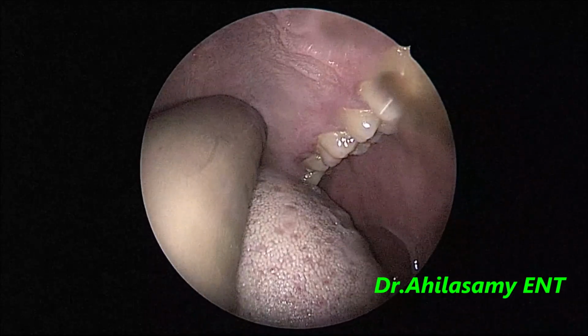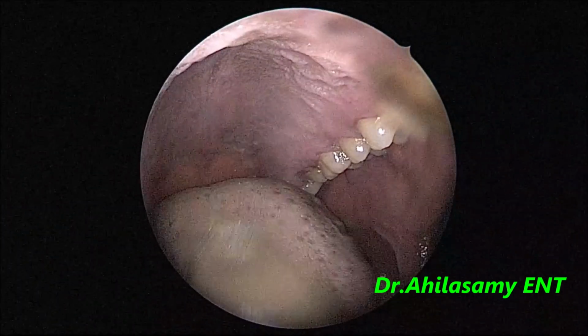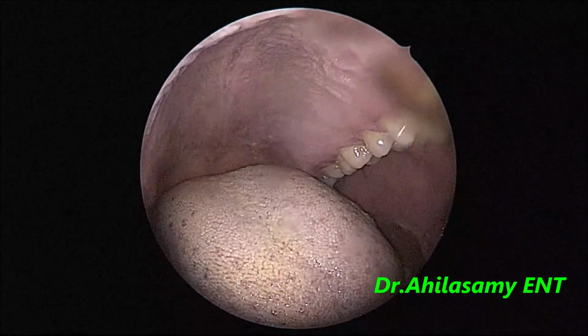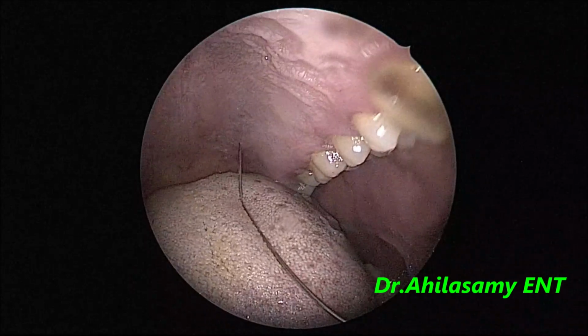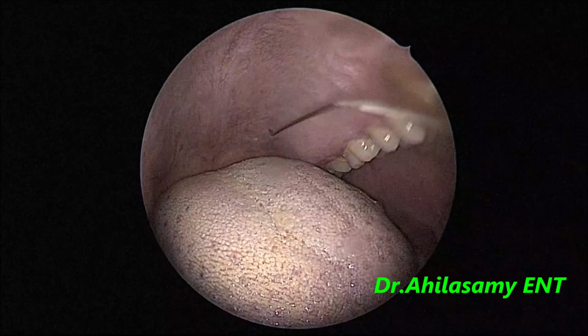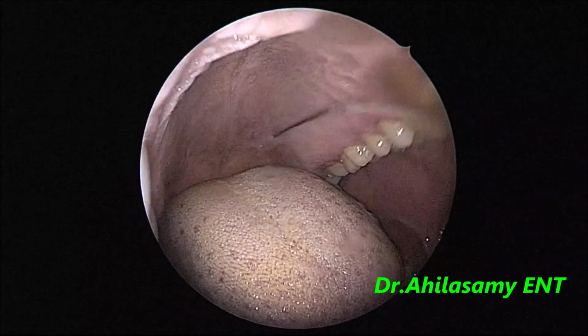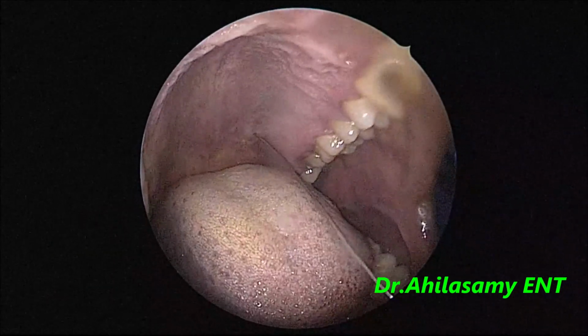Since we cannot give a block inside the nose because of the spur and edematous inferior turbinate, and we couldn't see the middle turbinate, I am going for the greater palatal block. I am palpating the hard palate posterior edge and 6 millimeters anteriorly between the gingival margin and the midline. I am palpating the foramen and giving with a 23 gauge spinal needle bent to 2 centimeters, and the 2 centimeters has to go in.